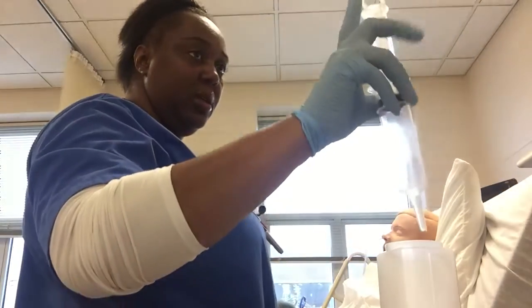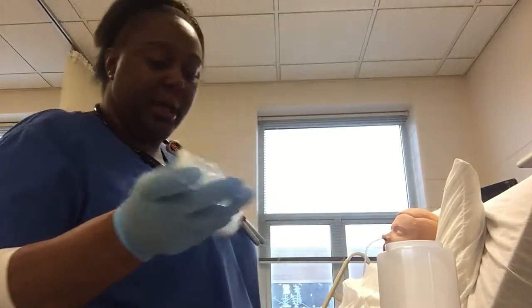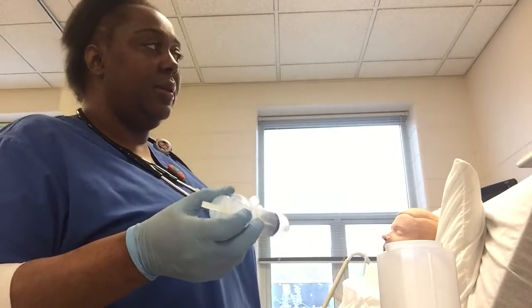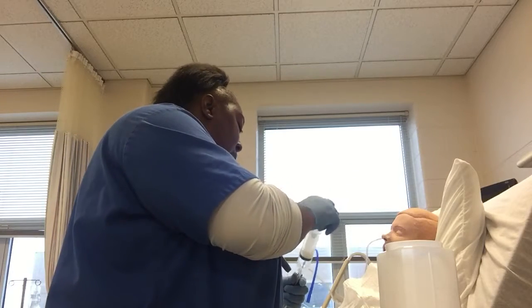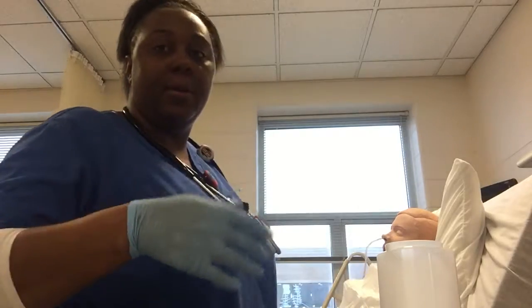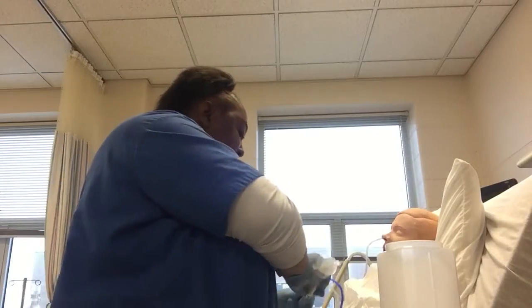All right, residual is less than 150 milliliters. Now what I will do, I will get about 25 to 50 milliliters of fluid, and I will put it into the line to ensure that it's clear, so that way I'm not giving them fluids and then it's just being clogged up.